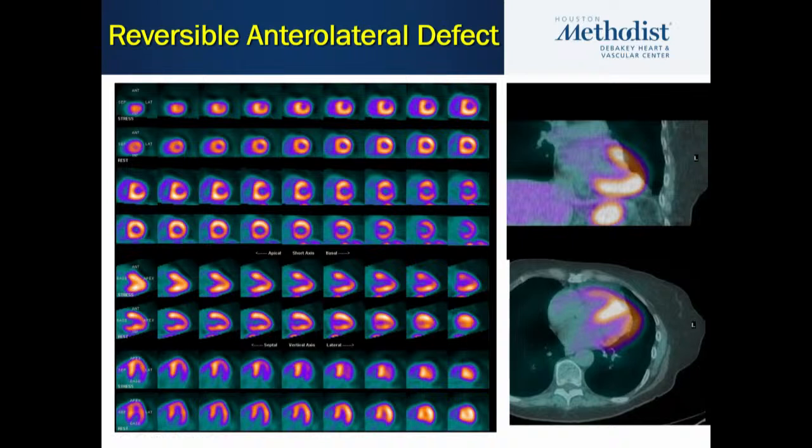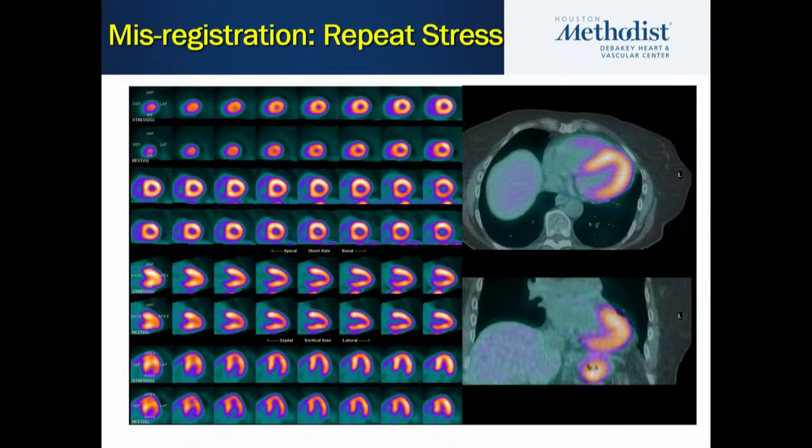So technically, it's not because there is a defect, because when I go back and fix it, now it looks normal. So this was purely induced by the fact that I'm correcting that anterolateral wall to the segment that is in the anterolateral, as if it was the lung, when in reality it was not the lung. So it's a pure artifact induced by post-processing. And it's very important to recognize it and correct it. So we do not want to have false positives because of this.